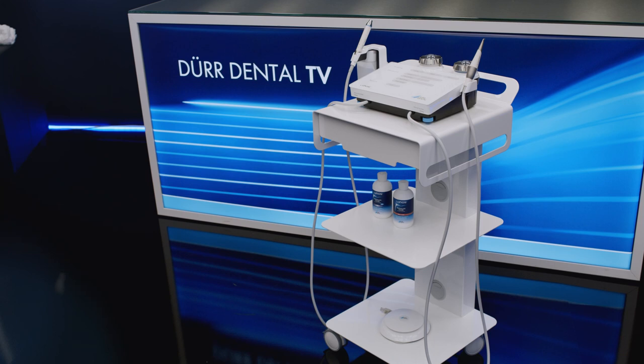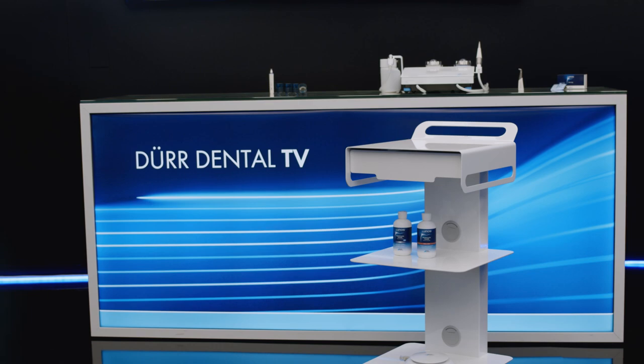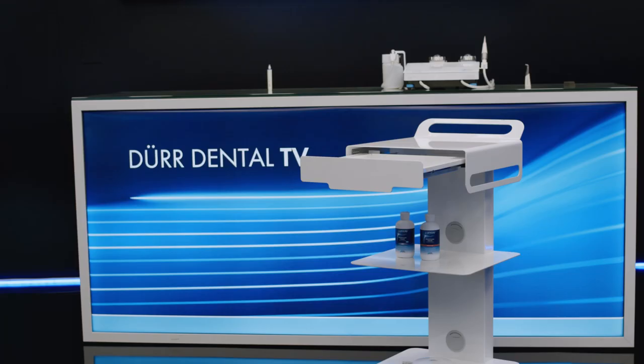The LUNOS cart is available as a practical accessory. It enables mobile use in the treatment room and can be positioned as and where necessary. The drawer, the two storage compartments, and the cable guides allow the treatment material to be organised and prepared in the best way possible.